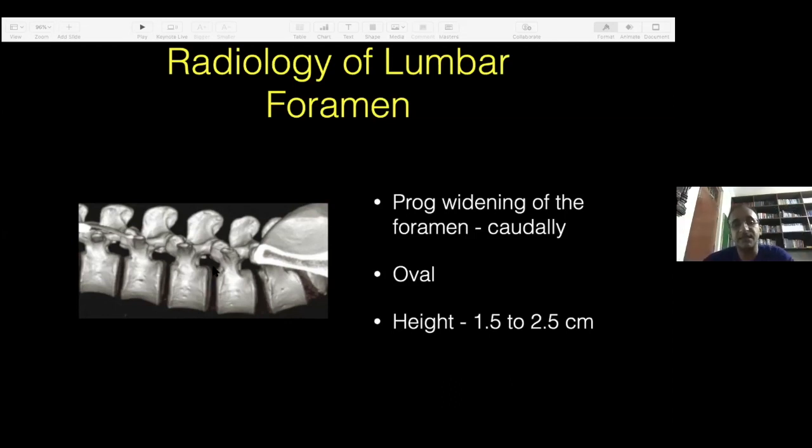So let's see, here you have the superior articular process. When you see through the endoscope, the superior part would be the superior articular process, the right side would be the pedicle, and the left side would be fat and the nerve root. And inferiorly, you will have the posterior longitudinal ligament and the disc.